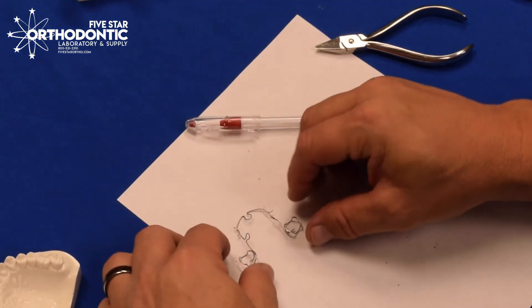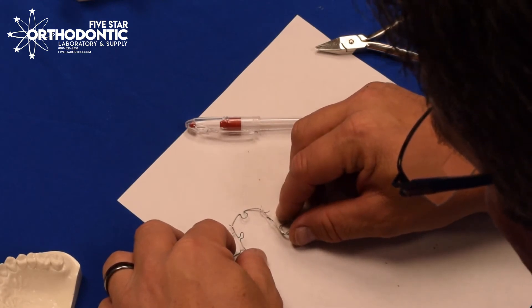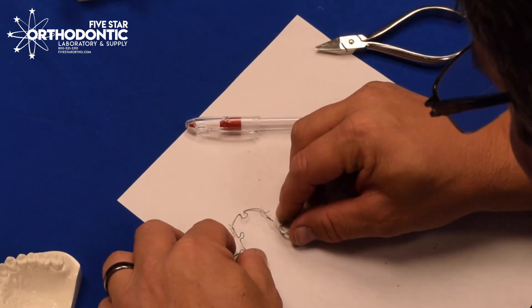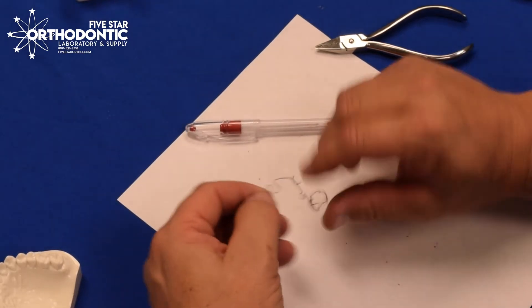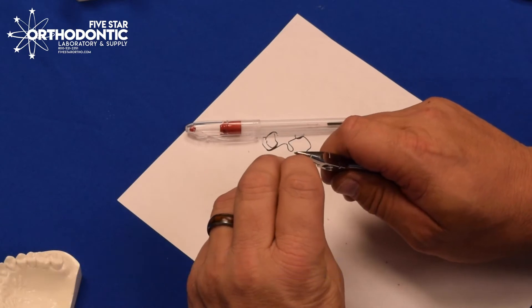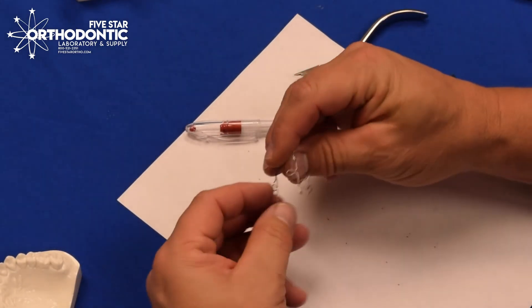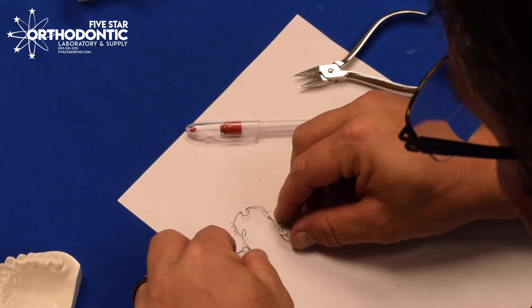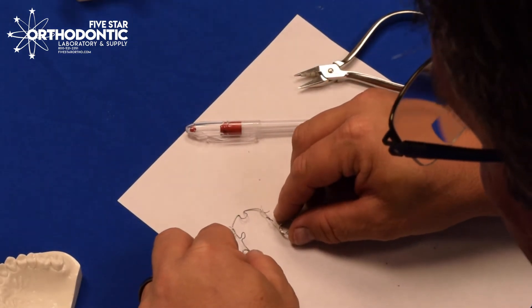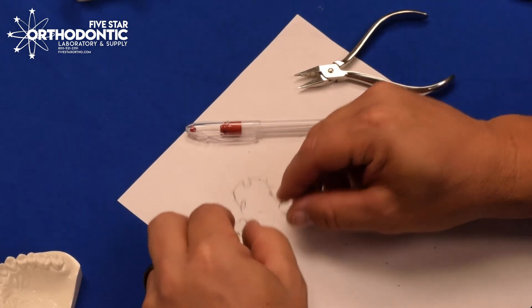Put it back on the area where you put your dots. I've activated that probably two and a half to three millimeters. With an ALF, you can go up to five millimeters of activation. I'll activate it one more time — that has moved it about three and a half to four millimeters. That's probably pretty good.